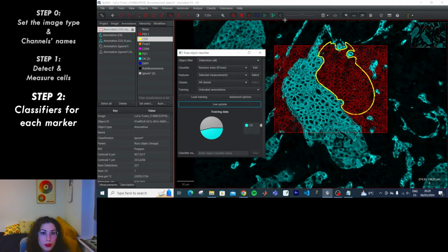And this has worked. This is giving me a classification. Then what am I supposed to do? This for each of them? Oh god. Okay, this is CK.